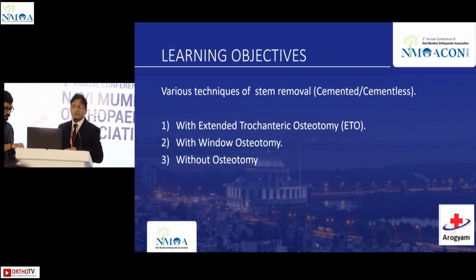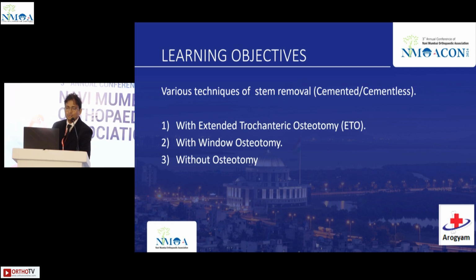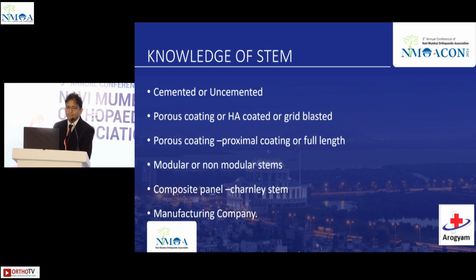Various techniques for removal of a well-fixed stem. It may be with a trochanteric osteotomy, it may be with a window osteotomy, or it may be without an osteotomy also. So we will look into all of the three.